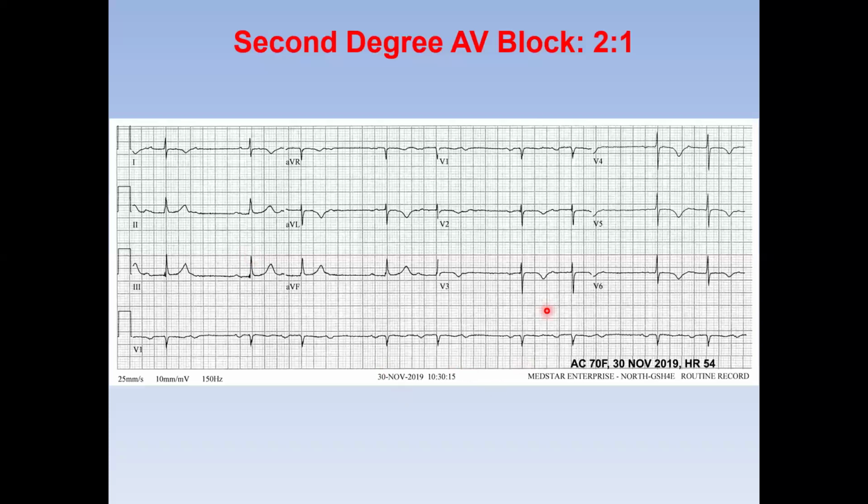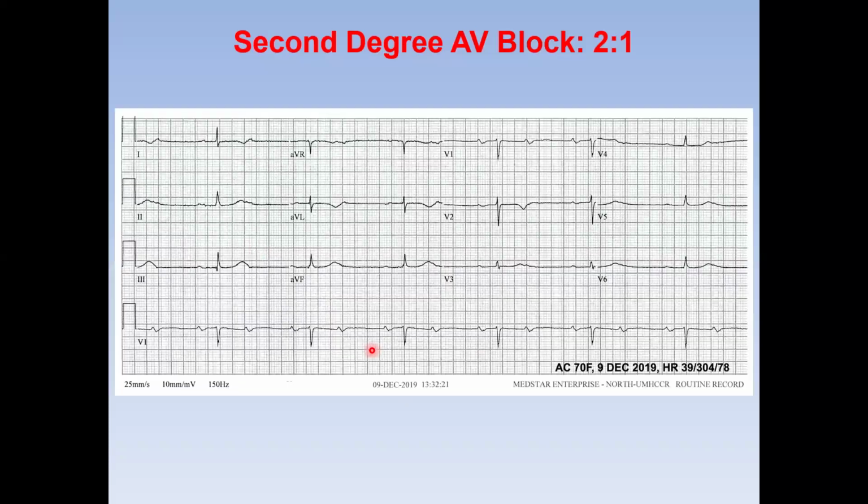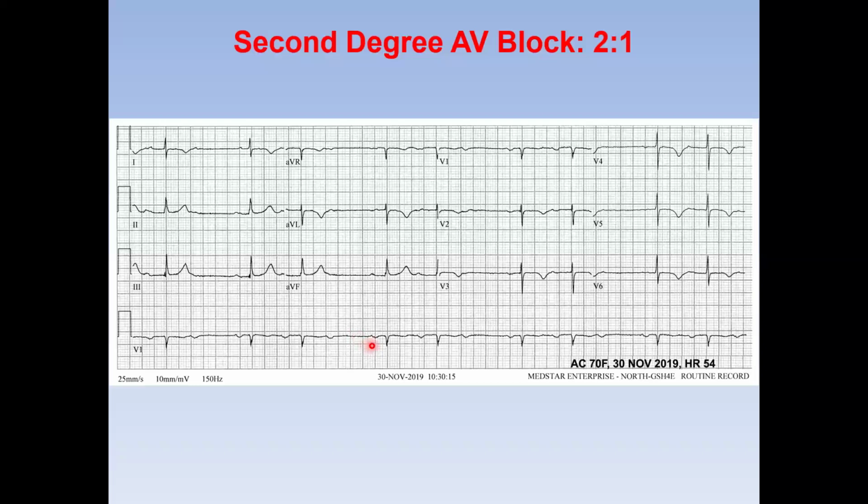Okay. So this is the same patient that had 2:1 before this one. And you can see here is Wenckebach. First degree at baseline, prolonged block. If I give atropine to this patient, if it is infra-His block, it will get worse. If I give atropine and the block is at the level of the AV node, conduction will improve. So that's, if you want to try, that will be the one. The other thing we do, I'll put this patient on a treadmill. And if on the treadmill AV conduction improves, that's most likely block at the level of the AV node. If conduction worsens, then it is infra-His.